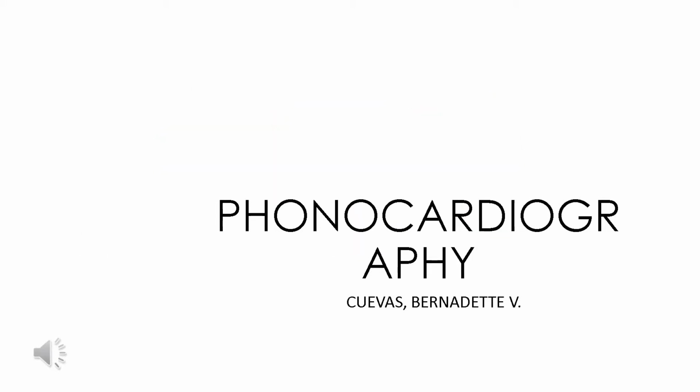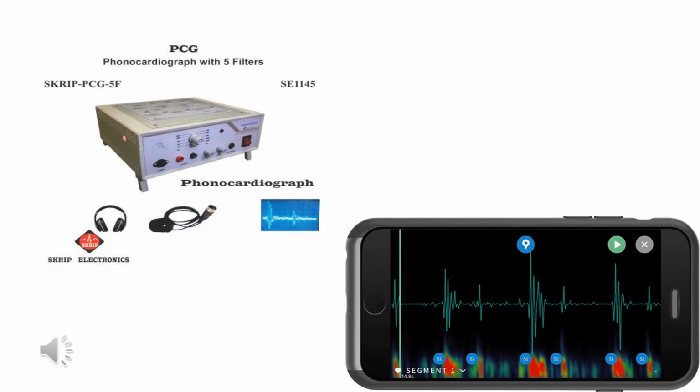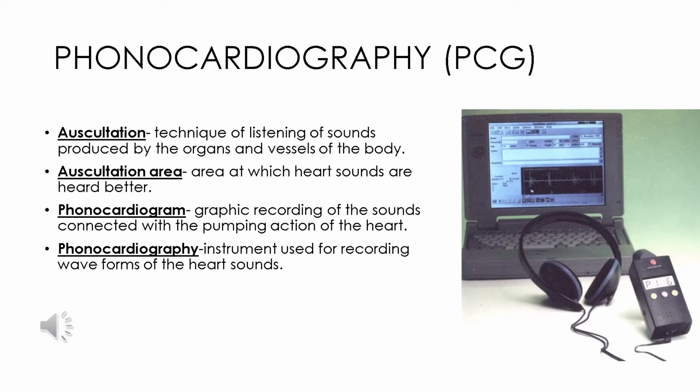Hello everyone, I'll be talking to you about phonocardiography, which is also known as PCG. This picture shows different types of PCG. One is the old type and the other one is connected to a smartphone. Before I tell you what PCG is, I'll define first what auscultation means.